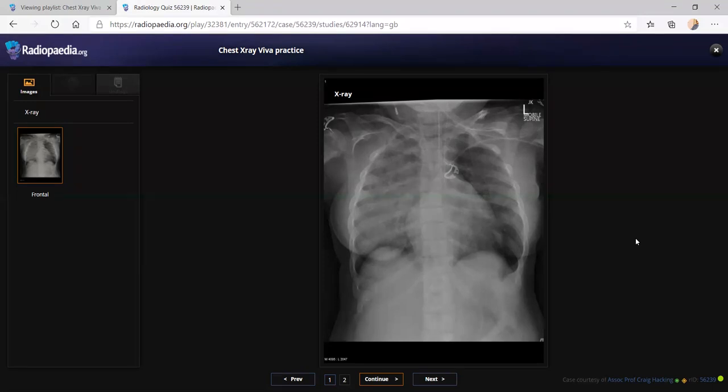The ribs appear to be slightly ribbon-shaped or spindle-shaped in nature, and the background bony architecture looks a bit unusual. Where is the central line? I cannot see a central line. There is some tube going from the left subclavian. Going where? That is going towards the heart. I cannot see the terminal endpoint actually. So maybe it's overlying the patient. I'm not sure.